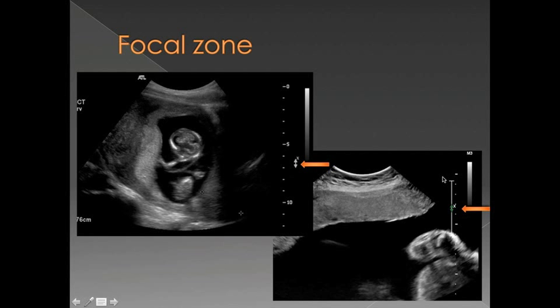This machine, however, gives you a range of focus. And so what does the focus mean? Well, the ultrasound machine is focusing its beam depth at this level, and so you should get more detail.